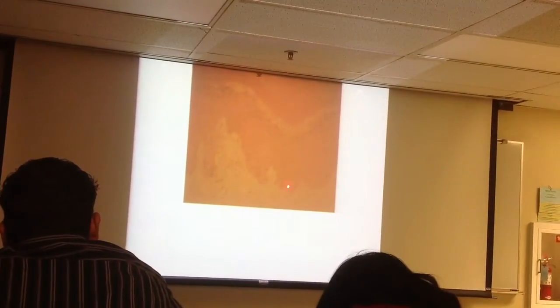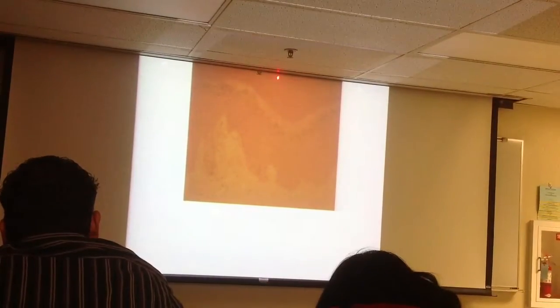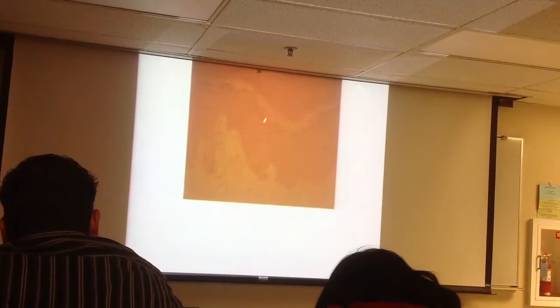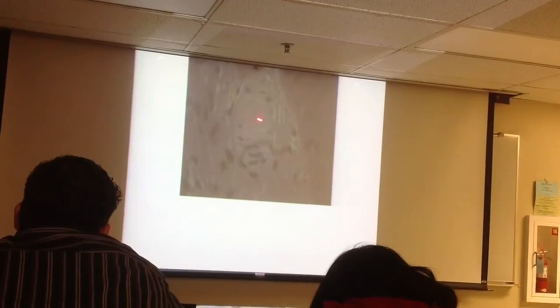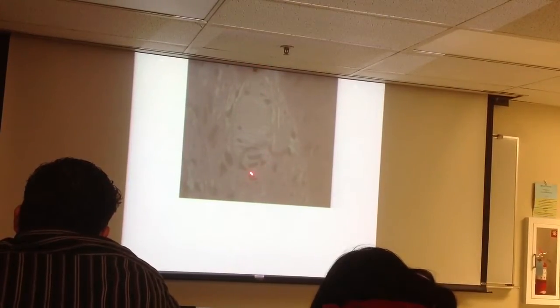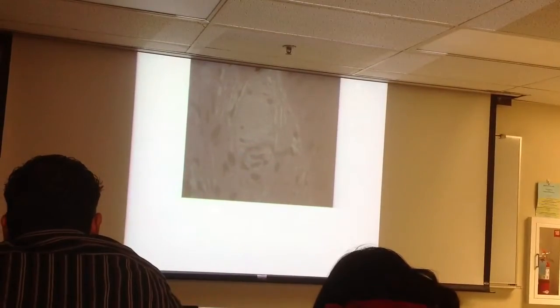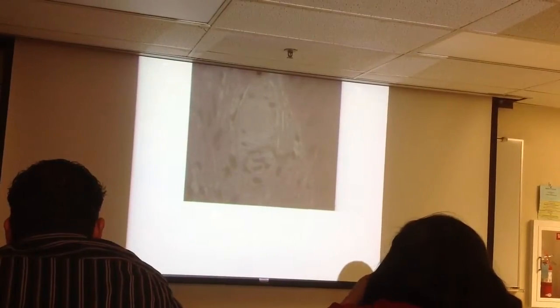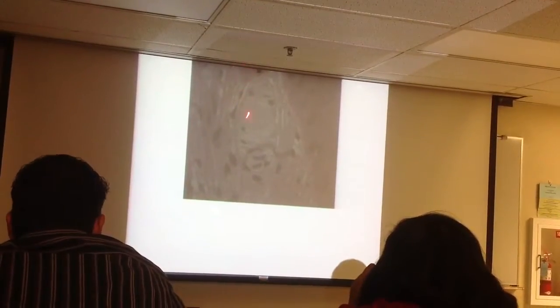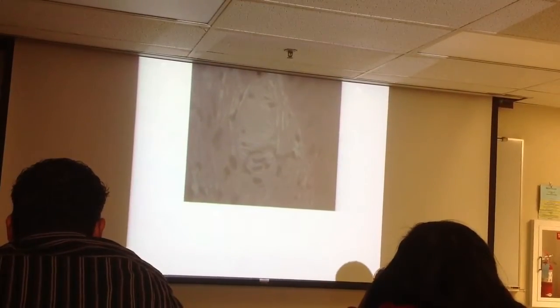Organ: skin. What type of tissue is all of this? The epidermis is all stratified squamous ET. And then this is pushing up into the papillary layer. What is this thing called? That's a Meissner's corpuscle. I have this one on top and the one from Flickr, which is much more elongated on the bottom picture. But they push clear up into the papillary layer. Function: touch.